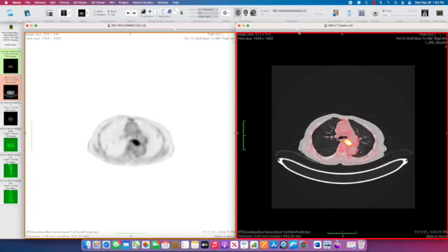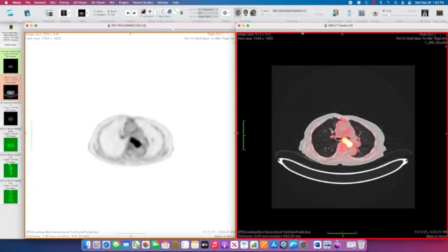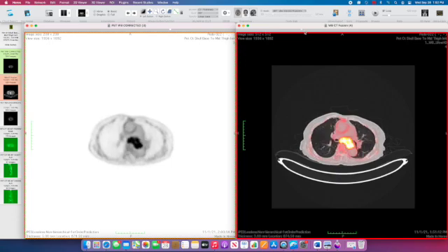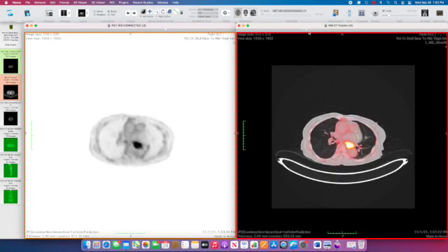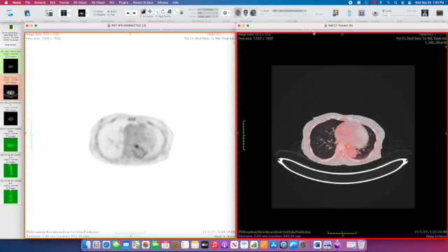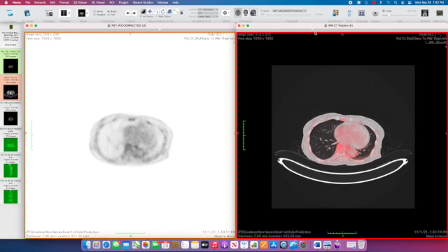So this is a case of a mid-esophageal cancer with mediastinal lymph node involvement as well as small metastatic pulmonary nodules.